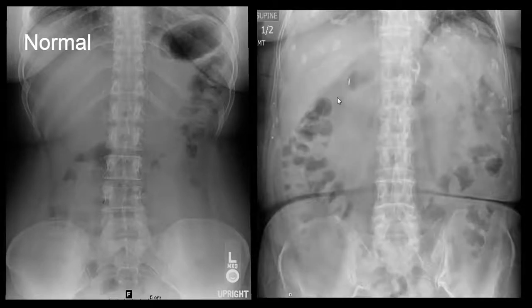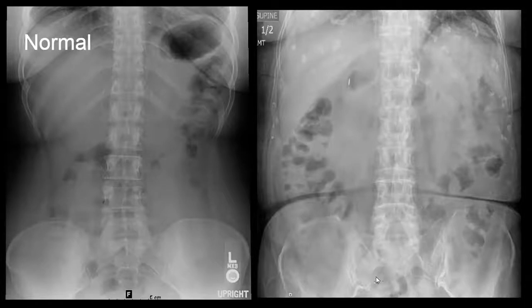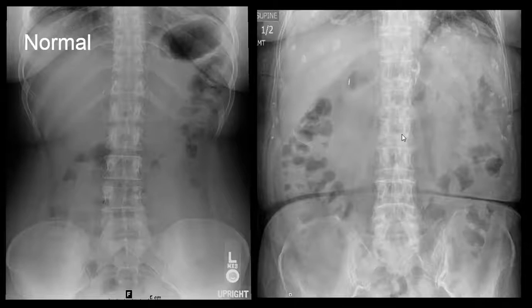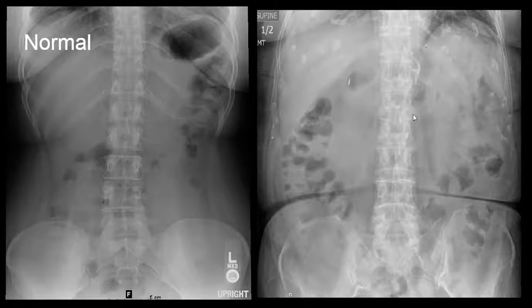Here's another example of a normal radiograph. This is an older patient. We can see costochondral cartilage calcifications here, a little bit of degenerative changes, but overall we're looking for a bowel gas pattern. The bones look degenerative in nature. Maybe there's a little bit of minor compression deformity from osteopenia, but otherwise there's no obstruction, no free air, no egregious findings.